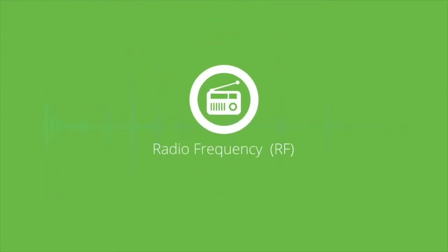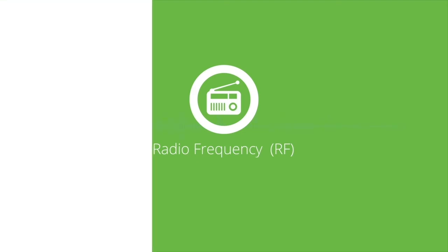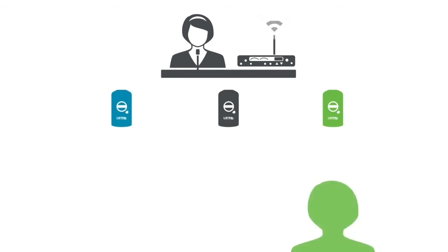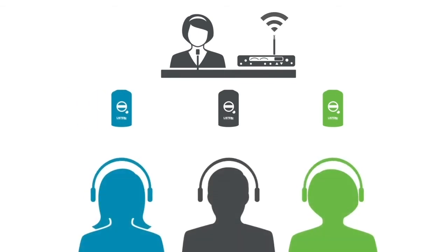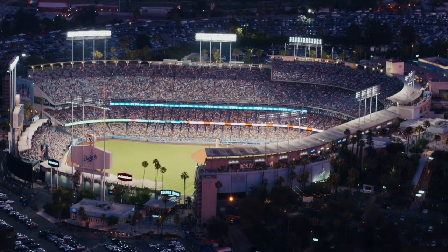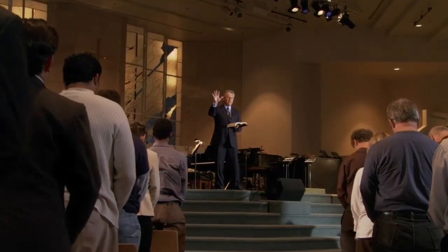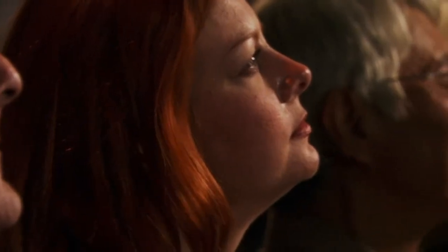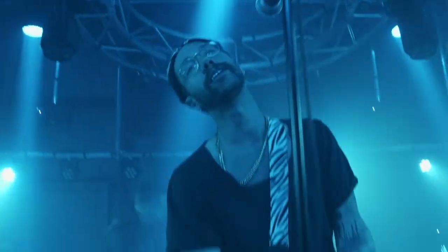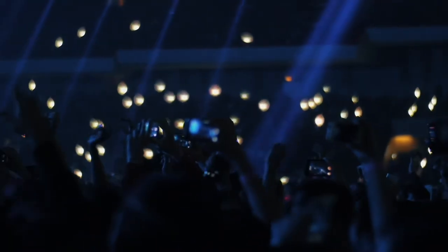An RF transmitter is positioned within a venue and broadcasts the signal via radio waves to receivers and headsets worn or carried by visitors. Audio is delivered to a receiver, and guests use a headset to listen to the audio, or an integrated neck loop that sends the signal directly to their telecoil-enabled hearing aid. RF systems are very popular thanks to their relatively low cost, good signal range, ease of installation, and ability to broadcast to different channels in the same area. RF technology is good for simultaneous translation applications, or providing audio in multiple spaces at the same time.